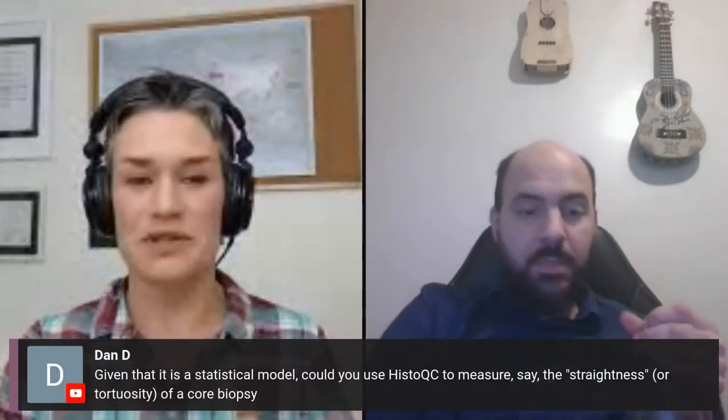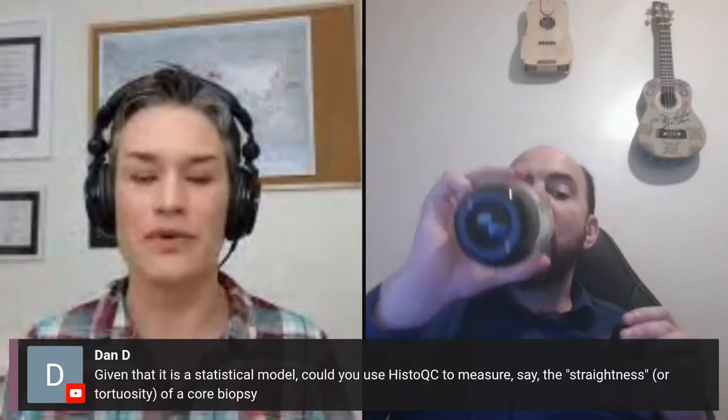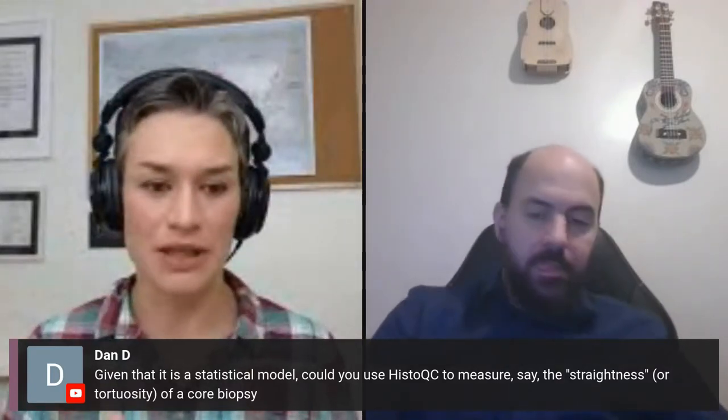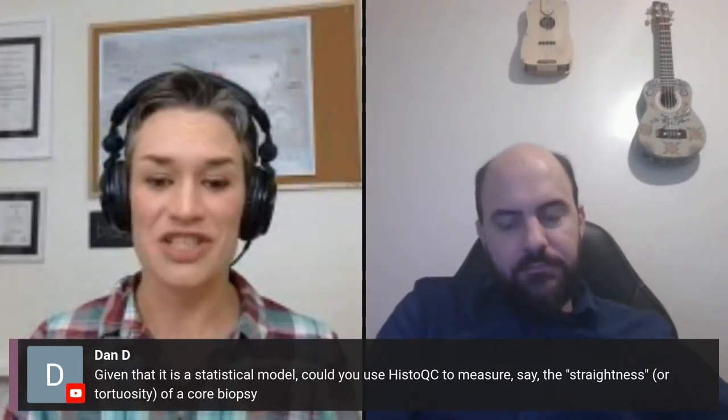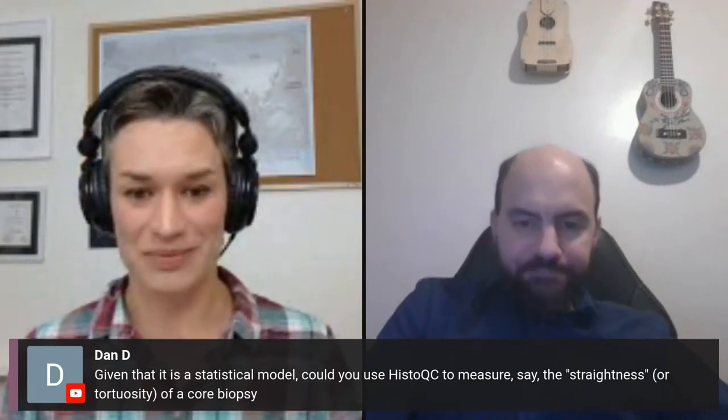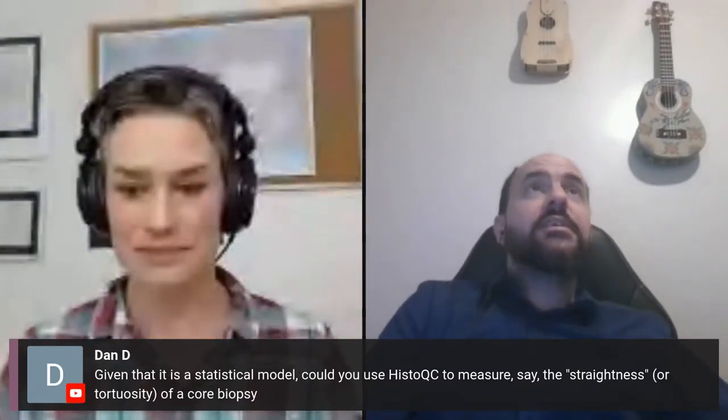So I'm going to just quickly ask one more question that is about the features that you're sorting for or asking HistoQC to give you an output on. Given that this is a statistical model, could you use HistoQC to measure, say, the straightness or tortuosity of a core biopsy? Yeah, I think that's a great question. So the idea is that currently no, right? Because I think the grammar of that question suggests that HistoQC has a statistical model. HistoQC has many, many features, right? So you would have to have a tortuous feature for that added to then be an anomaly.